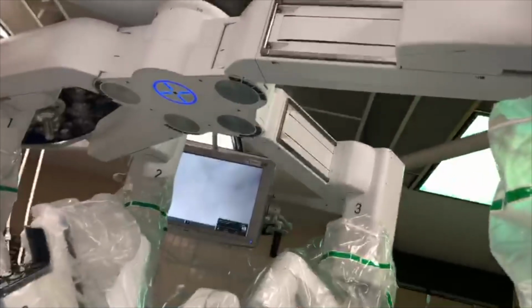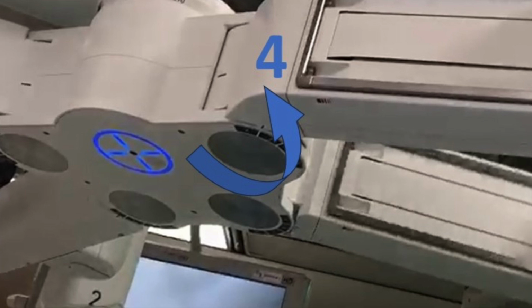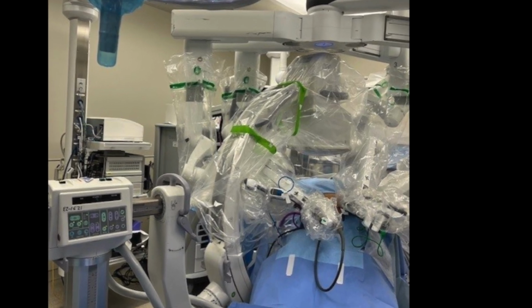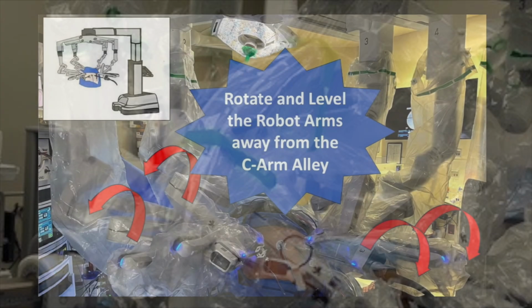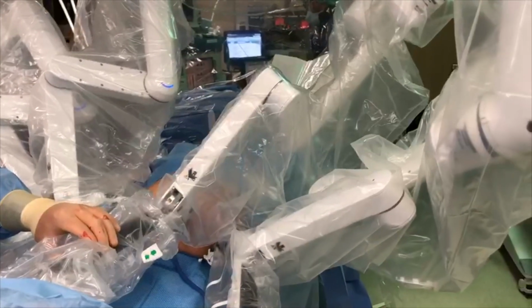Instead, dock the remaining ports and then swing number 1 and number 4 out to the far limits of patient right and patient left, and then move ports 2 and 3 right and left to near limits as well. This begins creation of the C-arm alley. The C-arm cannot reach over the robot's arms when they are in an usual near vertical position. Instead, all arms must be rotated as close to parallel to the floor as possible.